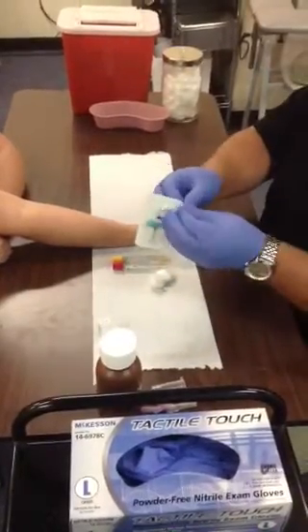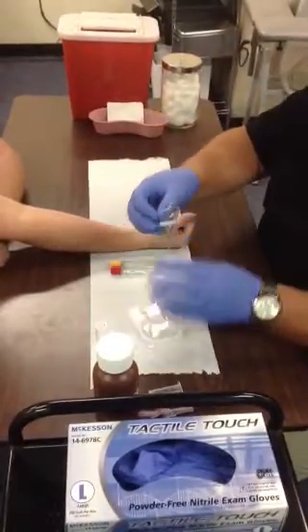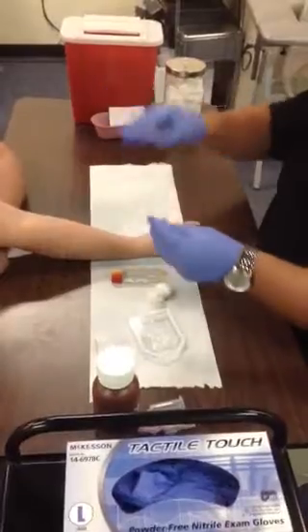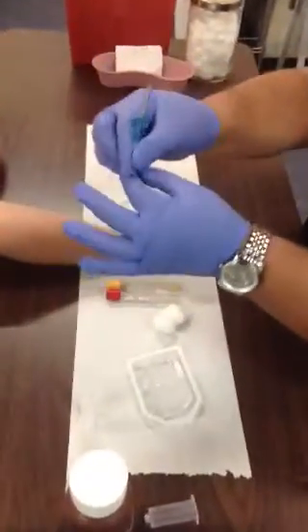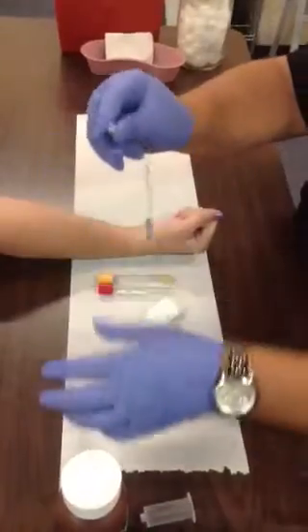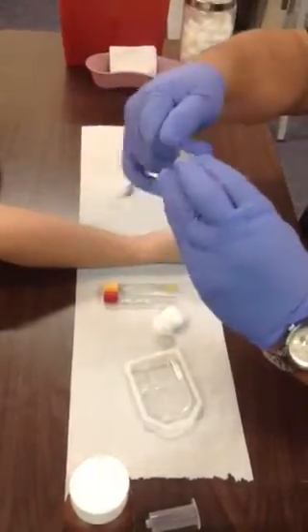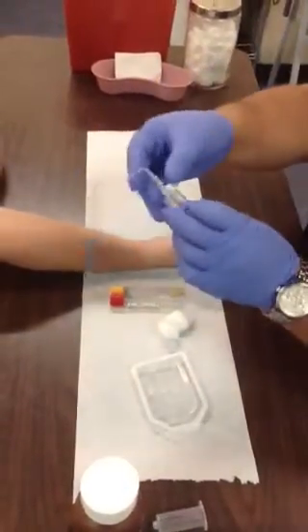We're going to prep this butterfly needle. Take the butterfly, take the little band off. With the butterfly, you always want to unkink your line — just kind of stretch it, don't tear it, but just stretch it. You're going to place the male adapter into the luer. Make sure it's nice and tight and everything's pressed in so that it doesn't leak.